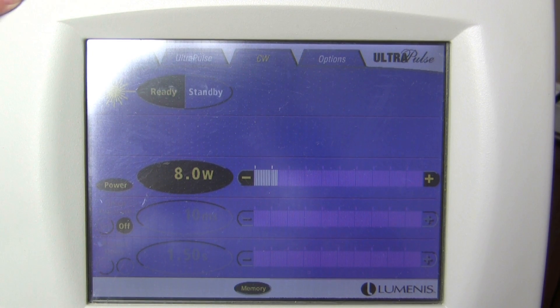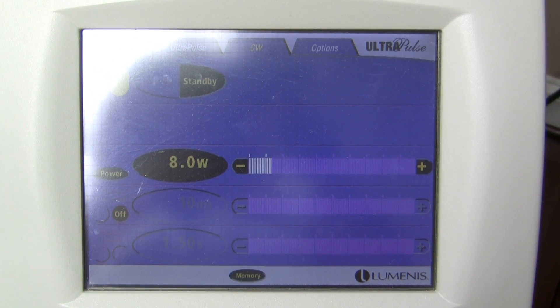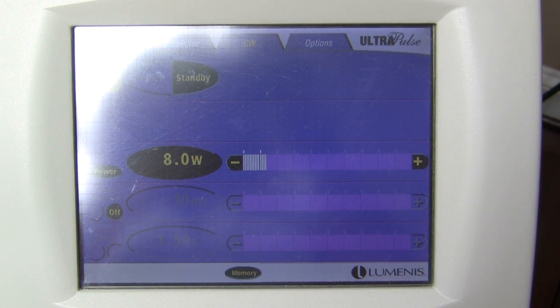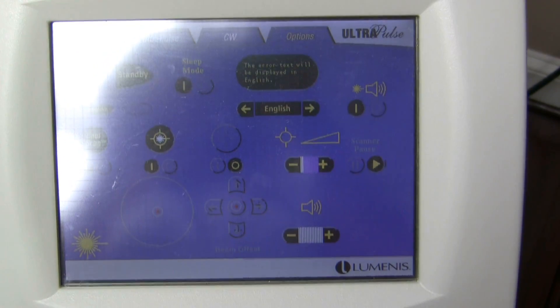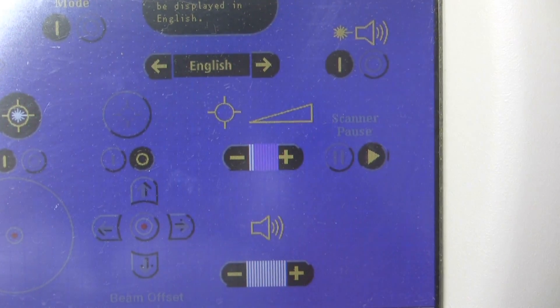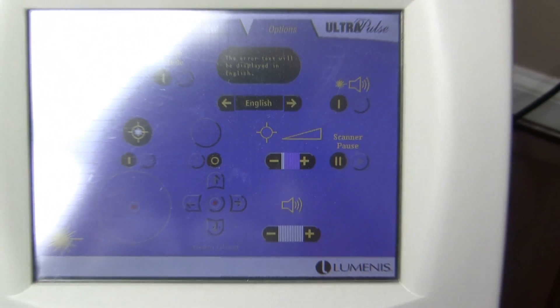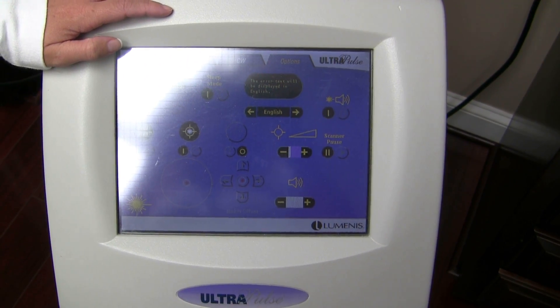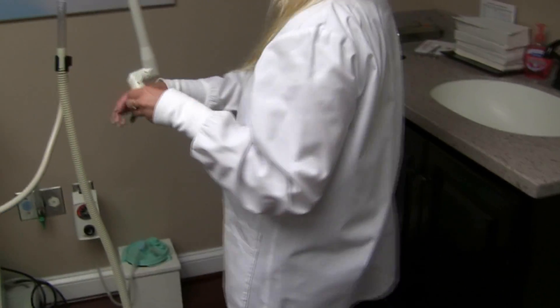When done, hit standby. Now we are going to show how to switch over to the CPG handpiece, which is the resurfacing one. We come to the screen, hit the options tab at the very top, and then to the right it says scanner pause — we hit the pause button. That lets the machine stay on without disrupting anything.